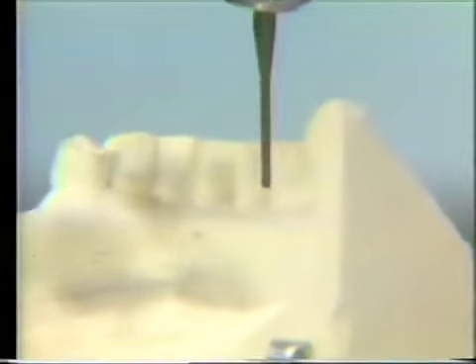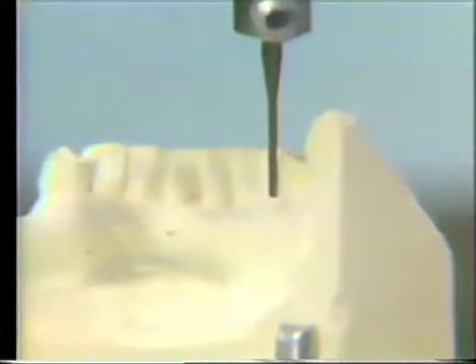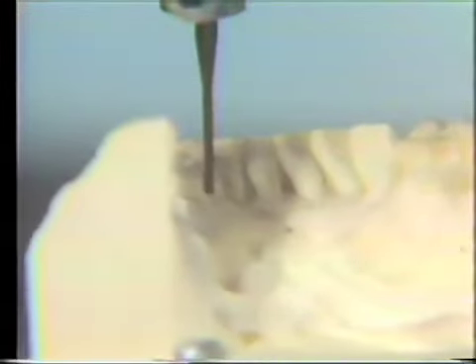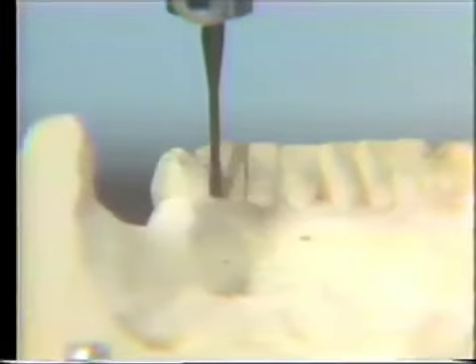right in this area. And we'll have to go back and check the lingual to make sure that if we do a crown, it isn't going to necessarily mean a gross reduction of that lingual surface. It looks just about the same as it did in the previous position. Now, going across the arch again, we're going to have to double check the bicuspid abutment to make sure that it wasn't altered. And I can see that it is altered very, very slightly from the previous position.